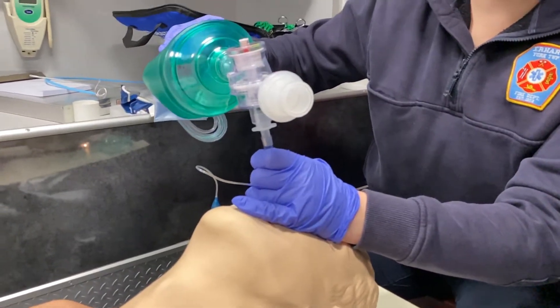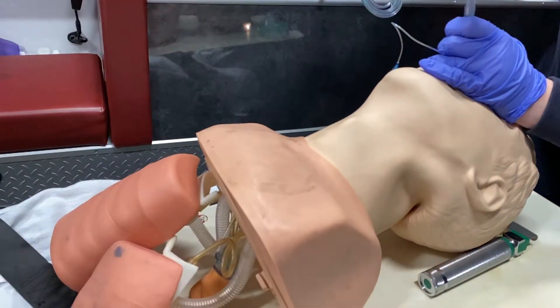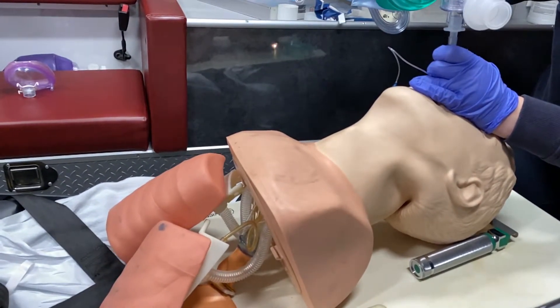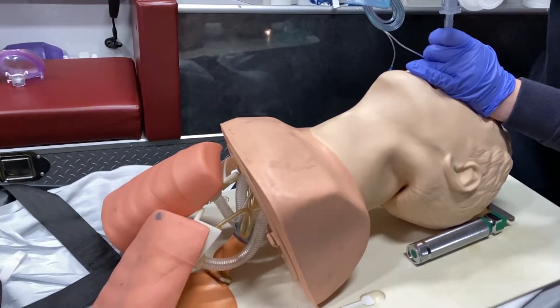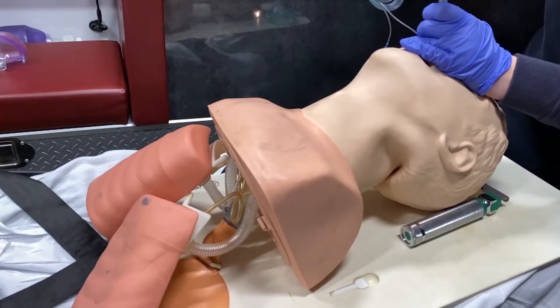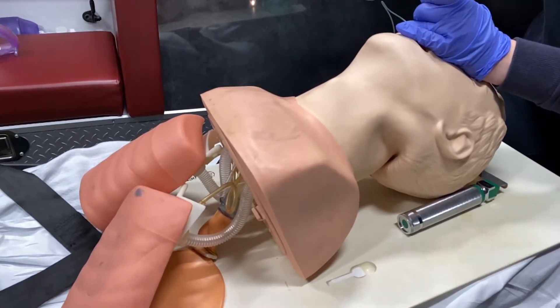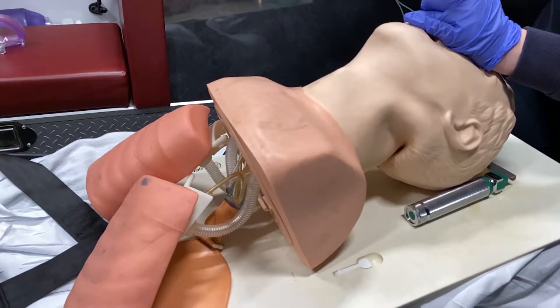This patient is easy to see because I can visualize his lungs. But we do want to check for lung sounds over the apexes and the bases to make sure we have lung sounds on both sides. And we want to listen to the epigastrium to make sure we don't have an esophageal tube placement — if we do place the tube in the esophagus, this will be fatal for the patient. Not only will they get gastric distension which will eventually cause aspiration, but they're not getting any oxygen to their lungs.